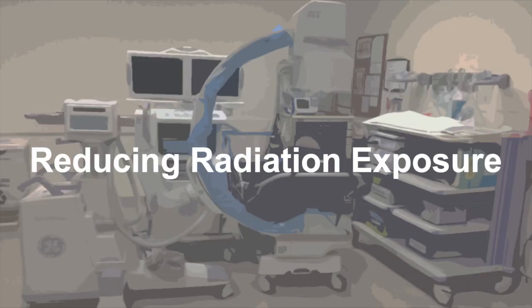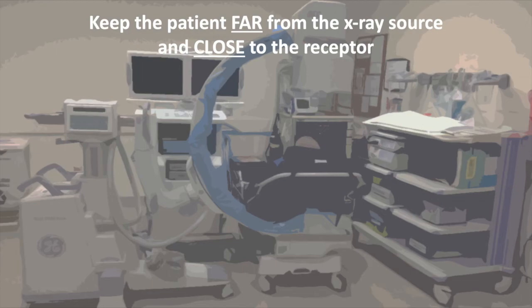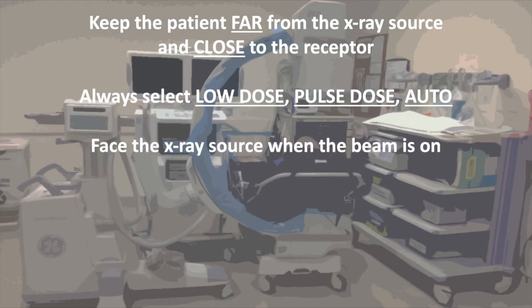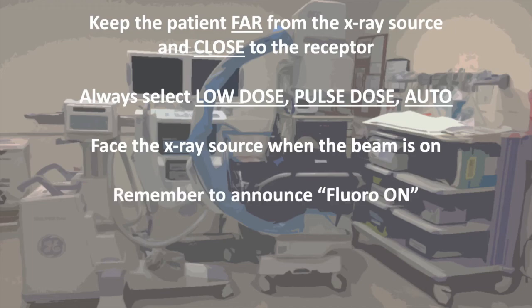In this video, we have reviewed several ways you can minimize radiation exposure for your patients, yourself, and others in the bronch suite. Remember, the patient should be at least 30 centimeters from the X-ray source and as close to the receptor as possible. The fluoroscope should be set to low dose, pulse dose, and automatic exposure mode. Ensure all staff know to face the X-ray source when the beam is on, and remember, loudly announce fluoro on every time you use the fluoro beam.